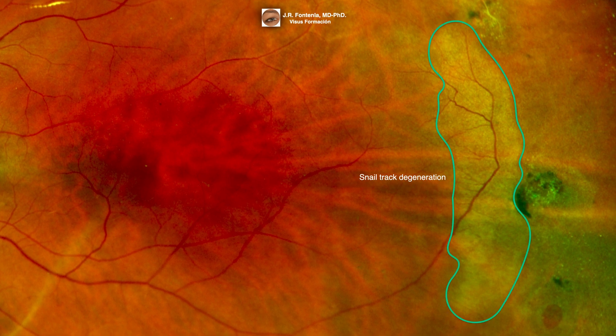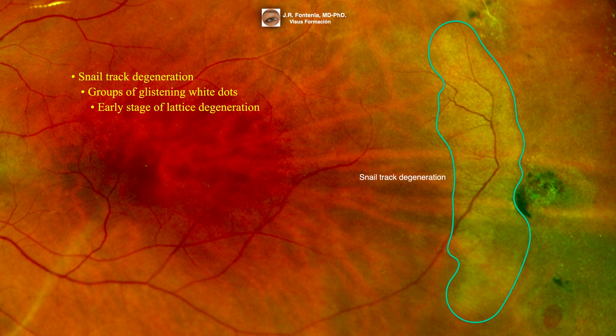Here we can see a snail track degeneration. It is defined as groups of glistening white dots, which have been compared to frost granules or salt. Snail track degeneration may be an early stage of lattice degeneration.